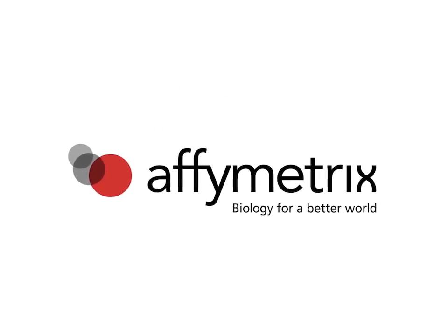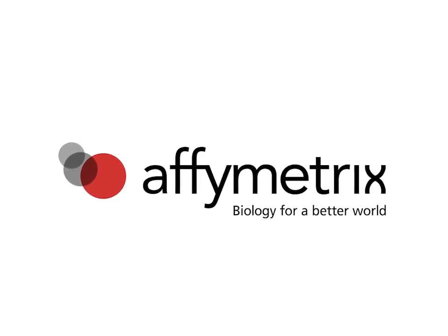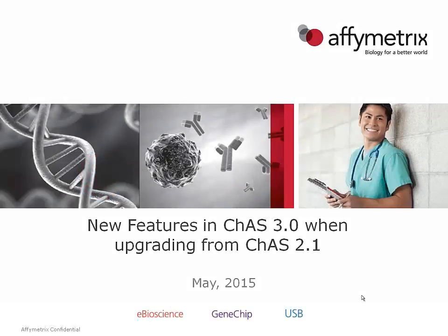This video is intended for those users of ChAS 2.1 to show what the new features are when upgrading to ChAS 3.0. So we're really not going to delve into the how-to and any of the real details of a single feature, but just give a brief overview of all the new features that were added to ChAS 3.0.